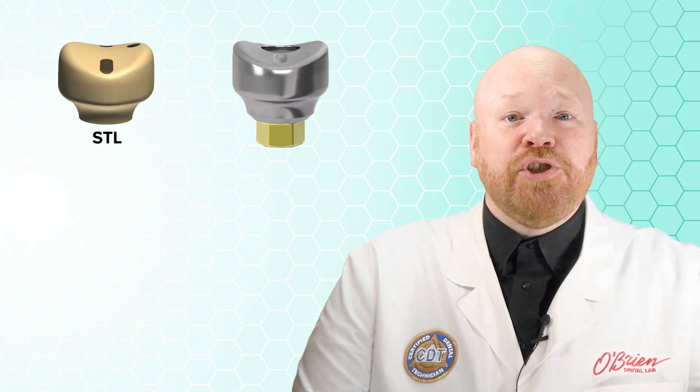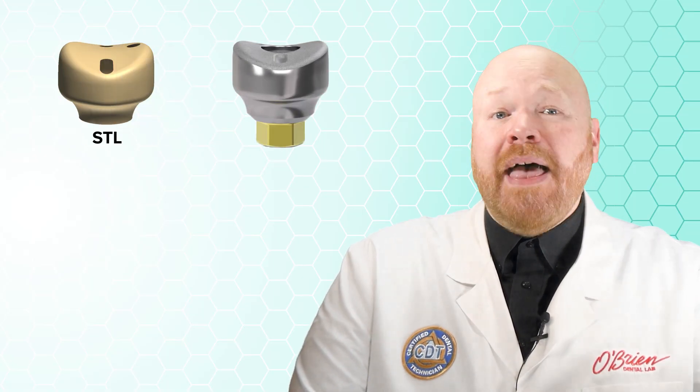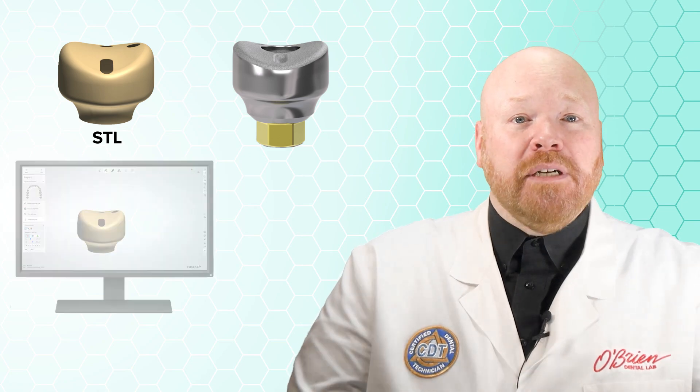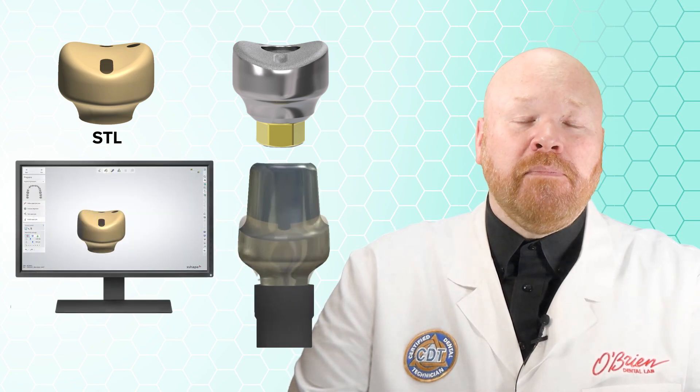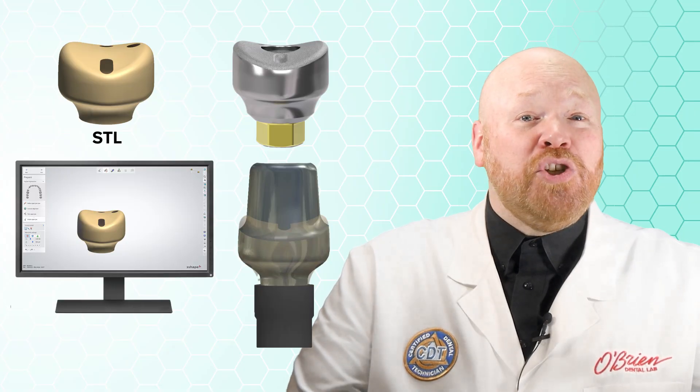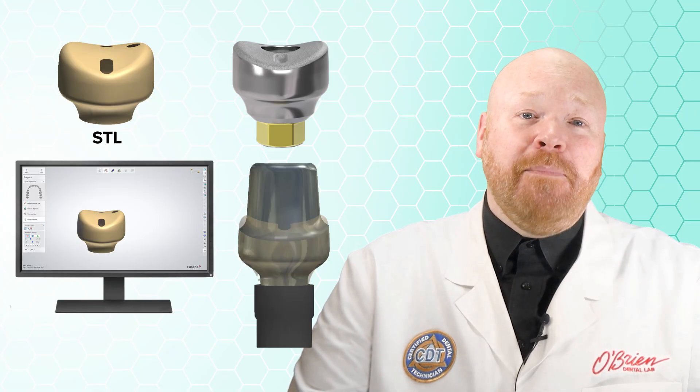Another really cool thing about these is that BioHorizons has provided STL files that mimic the entire shape of the healing abutment, including the subgingival contour. That means we can import that shape into our design software and adjust the final abutment to match it. A final thing to note is that you should check with your lab before using these to verify that they are set up to accept them.